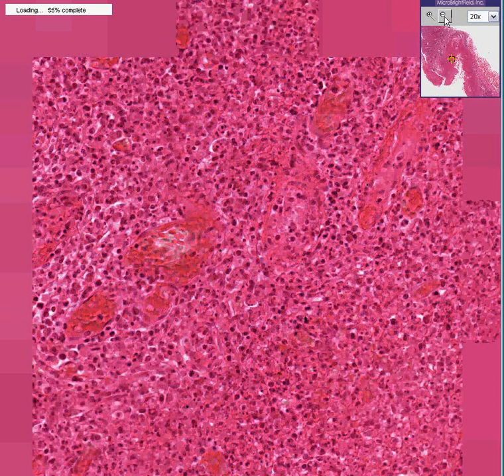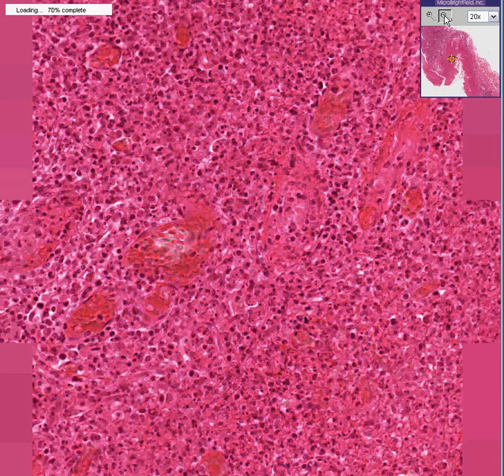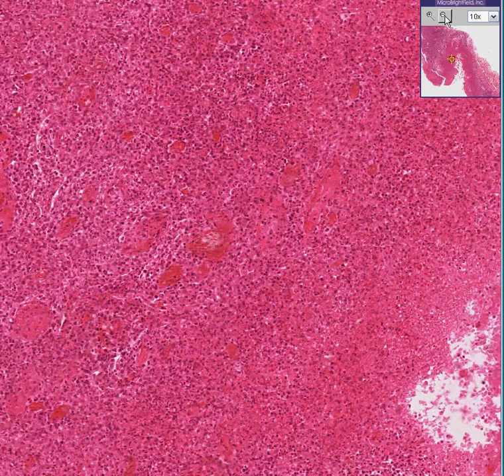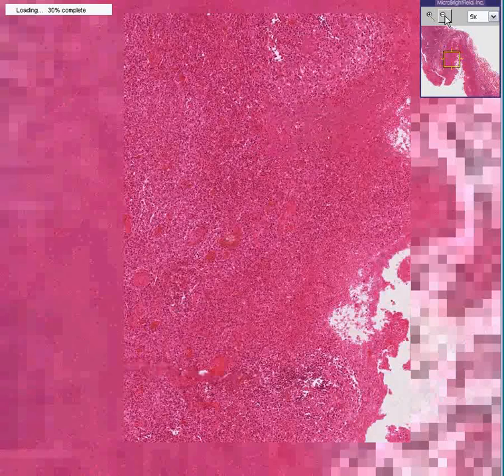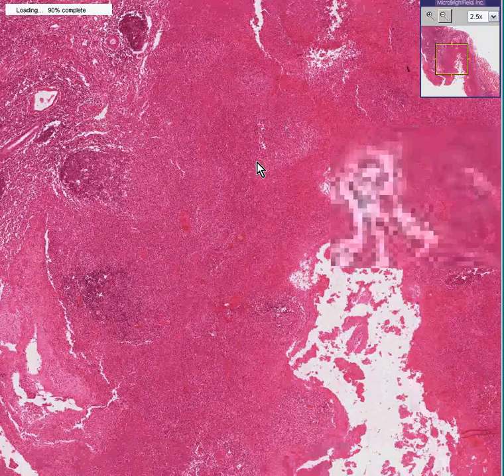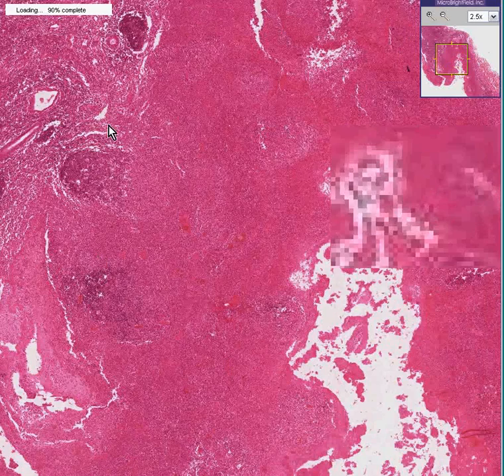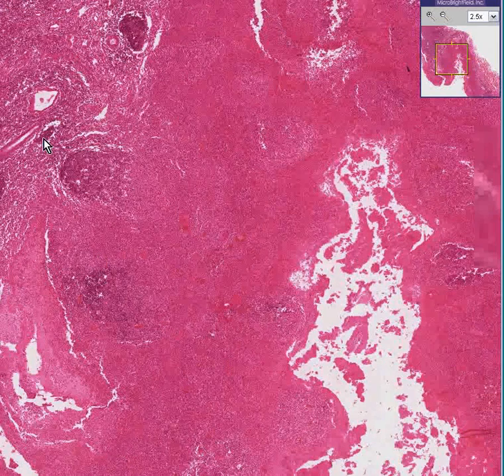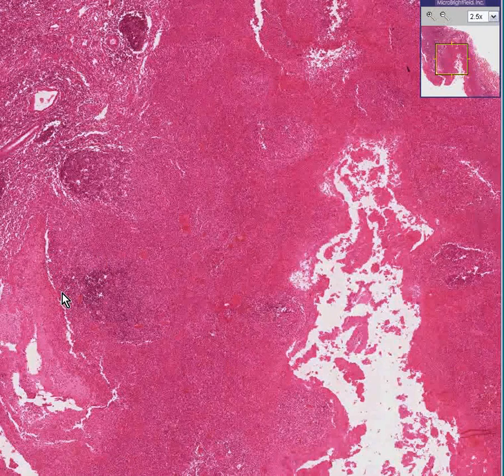This is an acute tonsillitis. It's also associated with a follicular hyperplasia as well, although follicular hyperplasia is more likely with a chronic tonsillitis.